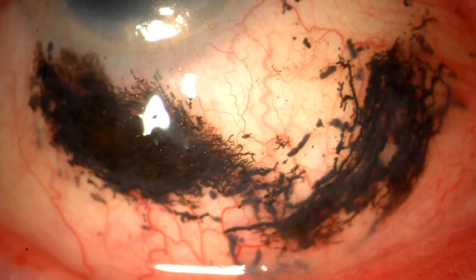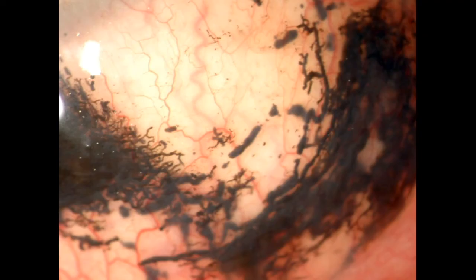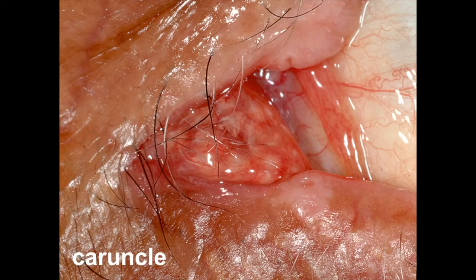This photo shows cutaneous malignant melanoma metastatic to the conjunctiva. The pigmented melanoma cells are growing within the lumen of lymphatic channels in the substantia propria.